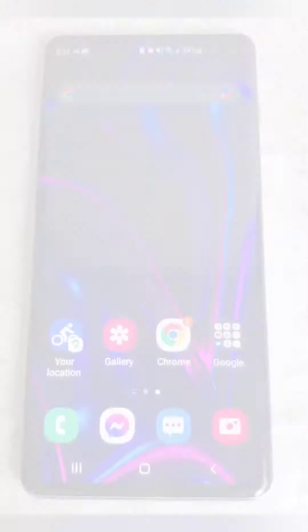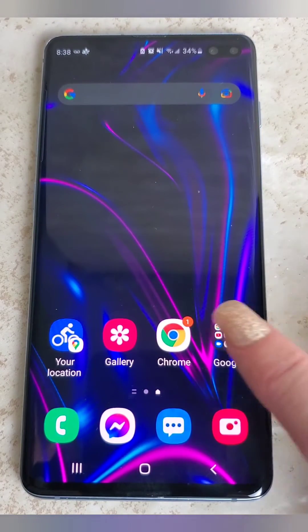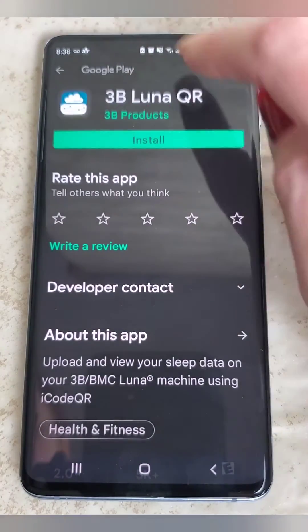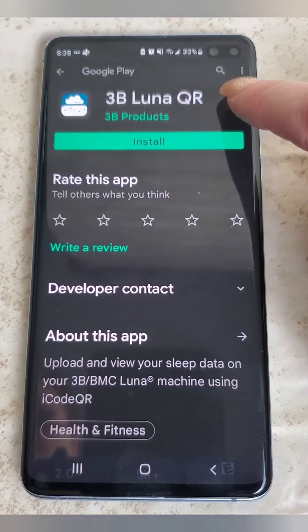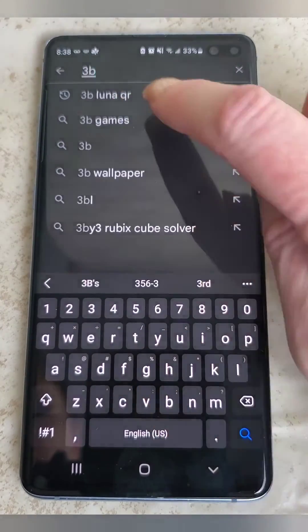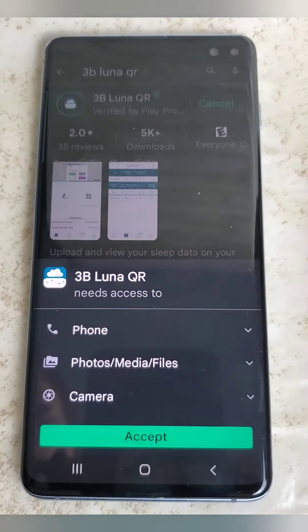You don't even need a username and password. You do need to go to either the App Store or the Google Play Store depending on what kind of device you have. I'm going to zoom on my Android here and show you how to do it. You're looking for your Google Play Store — it's usually on your Google cluster and it looks like a triangle. You're going to want to install the 3B Luna QR app. Hit the magnifying glass, begin to type '3B' and 'Luna' and it will pop up on your list, then install it.